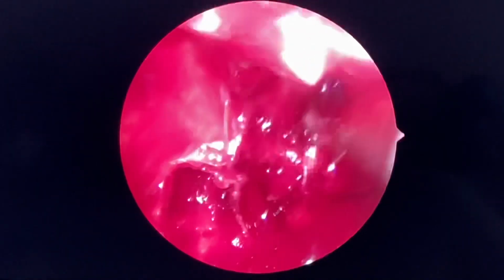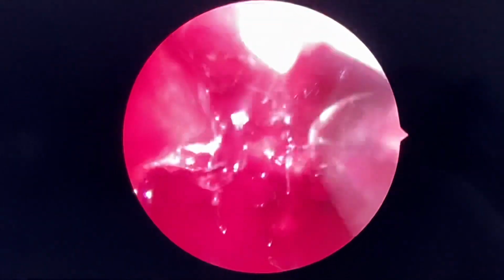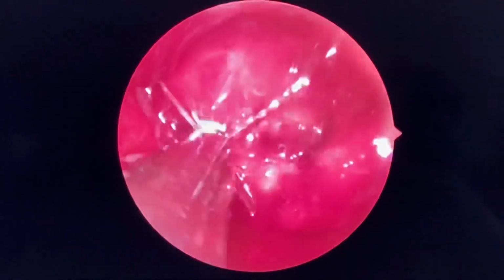We have removed the pterygoid body. This is the Vidian canal. We have removed the medial and the lateral wall of the pterygoid plates. Then further going laterally, this is the area of the cavernous sinus. This is the greater wing of the sphenoid, wherein we can see the dura of the temporal lobe.